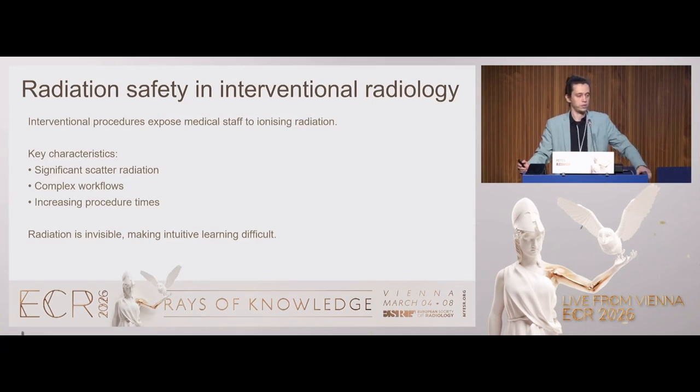So yeah, I can probably skip these. The main difficulty of training at the moment is that you can't see the radiation that you're exposed to. That usually leads to two extremes. Either people don't care or people are super paranoid, and both are unhealthy.